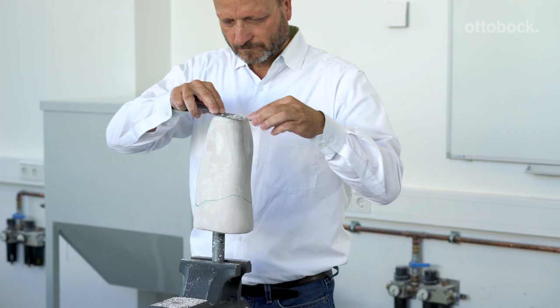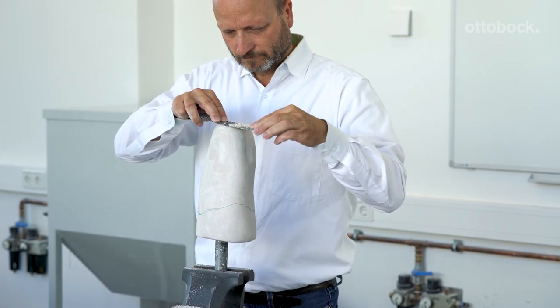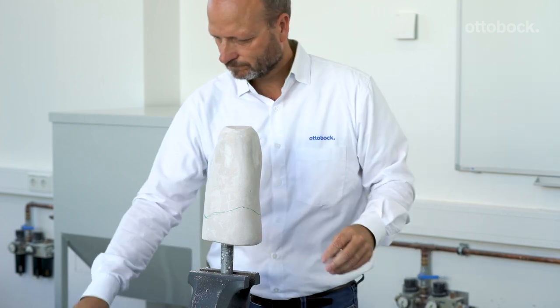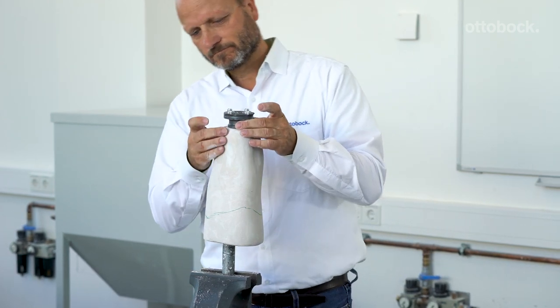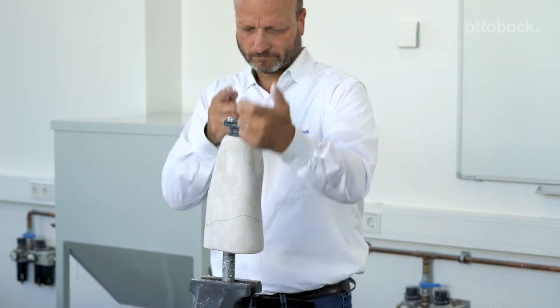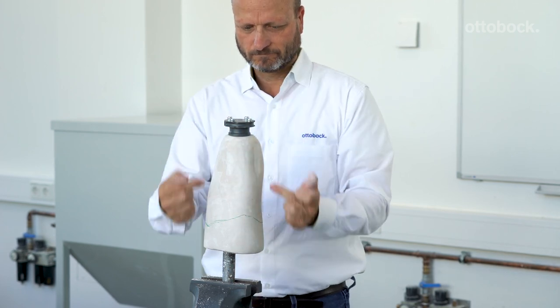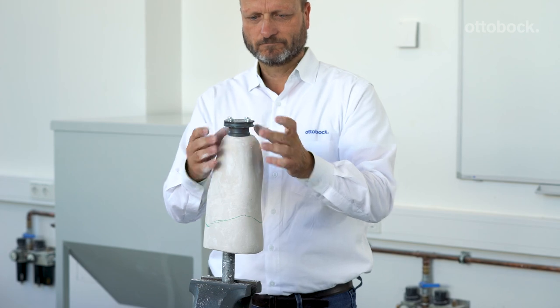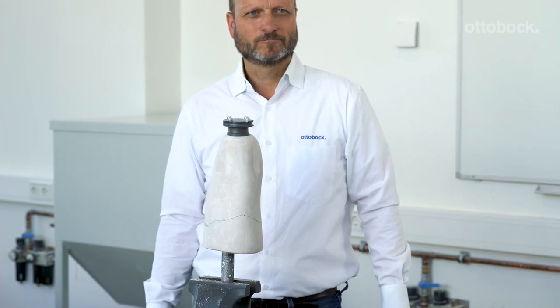It is important that you flatten the bottom of the cast to receive the piston dummy and prepare it in the proper position. You want the DVS unit to be in the longitudinal axis in both planes. This is going to receive the very center of the distal end of the DVS liner when the patient dons the prosthesis.